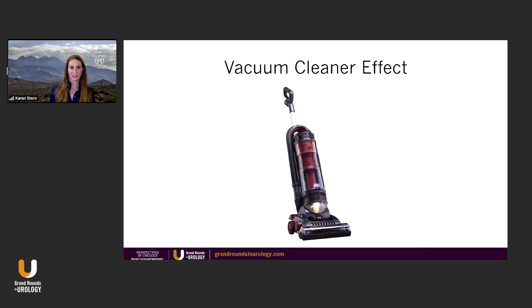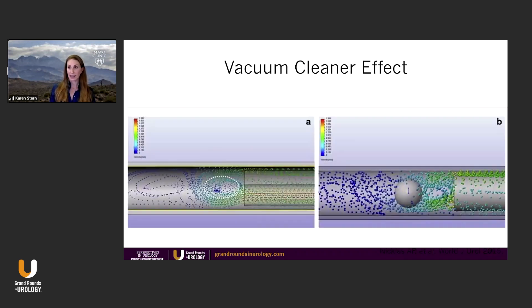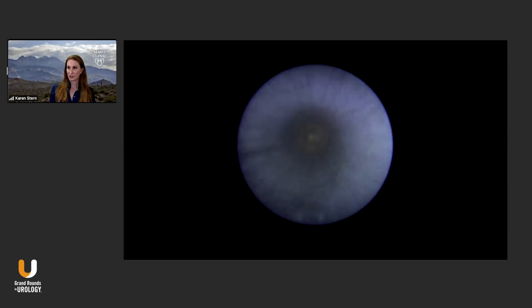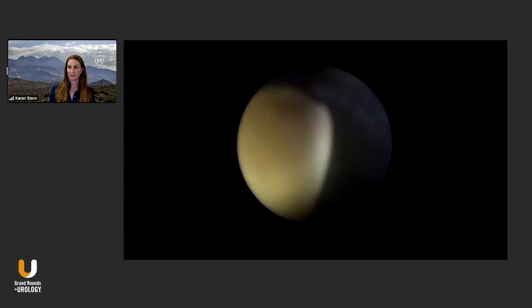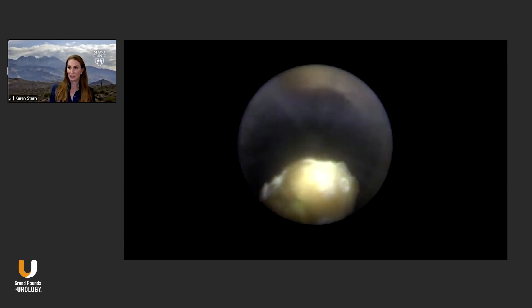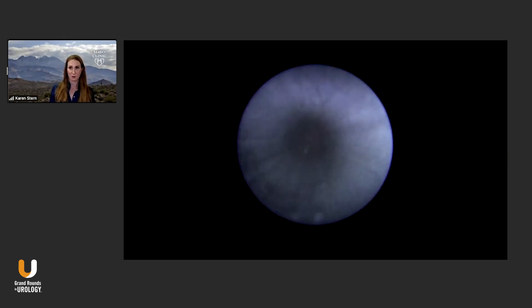Why does it work? It's the vacuum cleaner effect. All the fragments are just suctioned out. It's the Venturi effect and Bernoulli principle — because of the diameter of the scope and the diameter of the sheath, the fluid gets trapped within there and comes out. This is a pretty bloodless procedure, not like a standard perk. The fragments just sort of come out of the sheath without really doing anything other than withdrawing your scope.